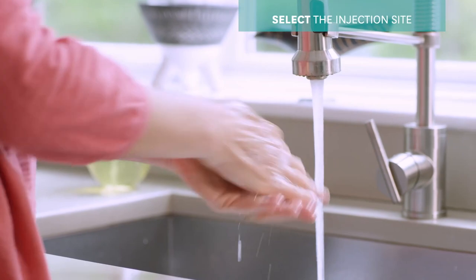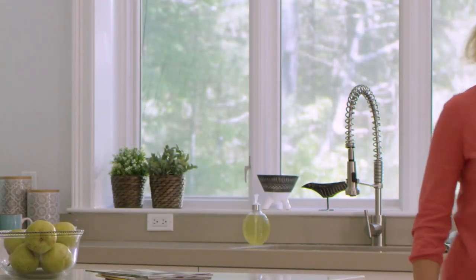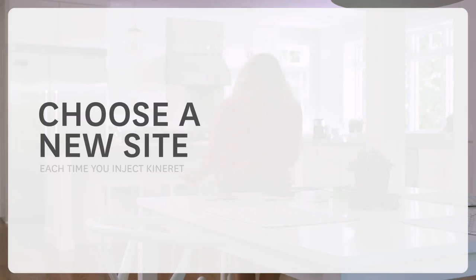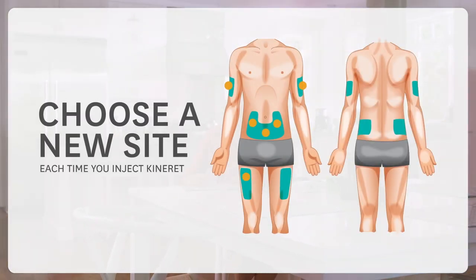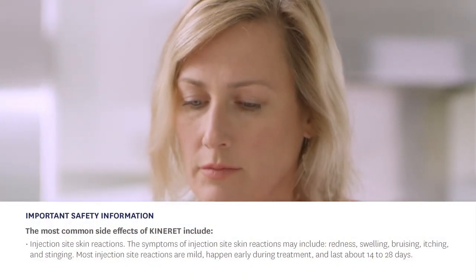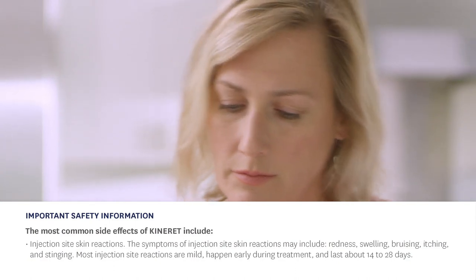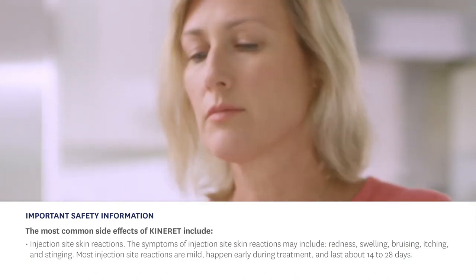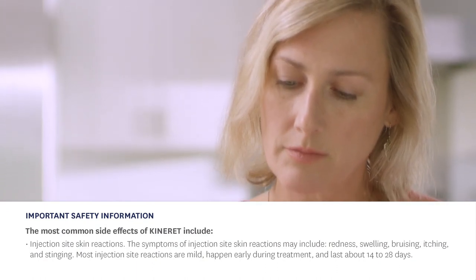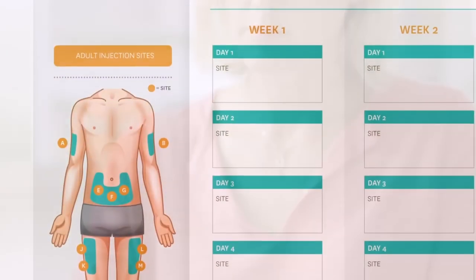Now it's time to select your injection site. Be sure to choose a new site each time you inject Kinneret. Rotating sites is really important because injection site skin reactions are the most common side effect with Kinneret. Most people get these reactions, which may be redness, swelling, bruising, itching, or stinging at the injection site. Injection site skin reactions are most common during the first month of treatment and they usually go away after about 14 to 28 days.